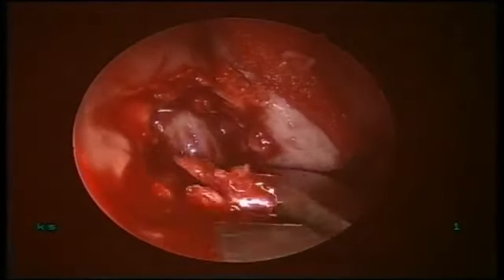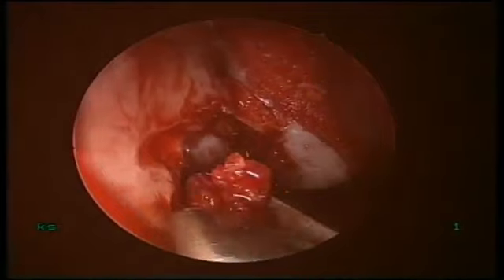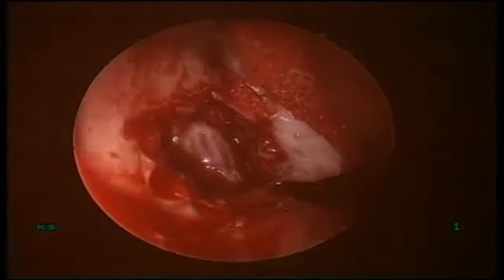I generally open wide and wide, whatever possible, so you can marsupialize a bigger portion of the duct.